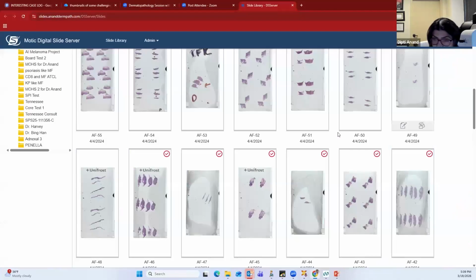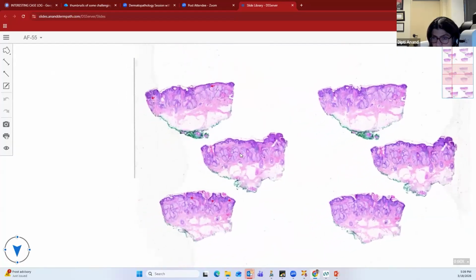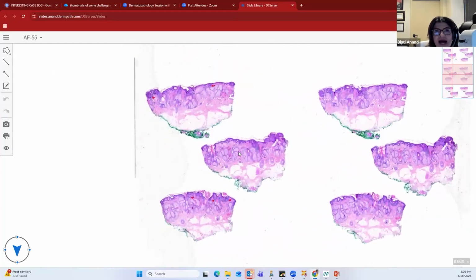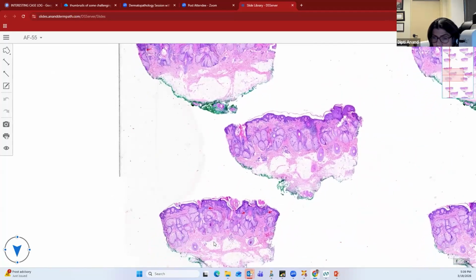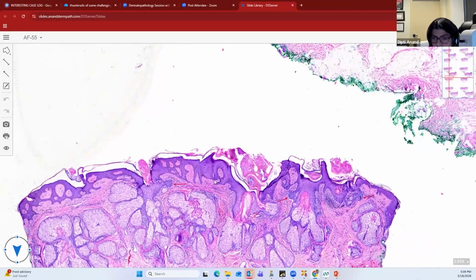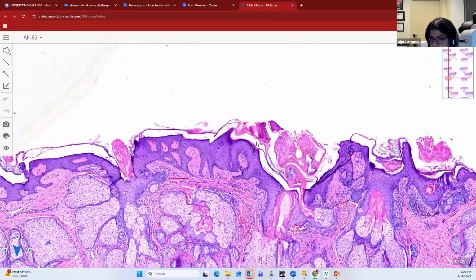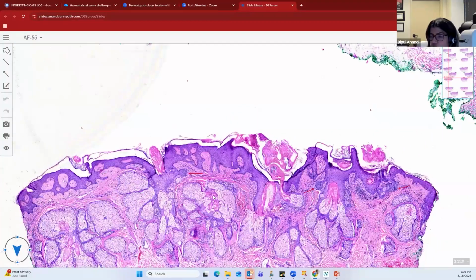The next entity we're going to talk about is a hamartoma, which is your nevus sebaceous. So nevus sebaceous is derived from the malformation of the pilosebaceous unit. Clinically, these present as a verruciform plaque with alopecia, and what you see is because of the immature hair follicle. The top of the lesion will look variably papillomatous. You can see the epidermis shows mild verrucous papillomatous hyperplasia. There are a number of sebaceous glands because there are no corresponding normal mature hair follicles.